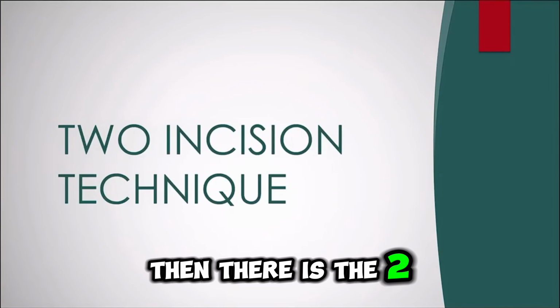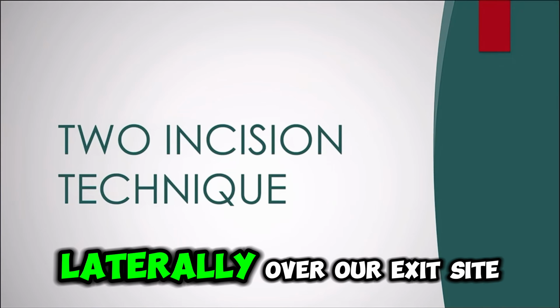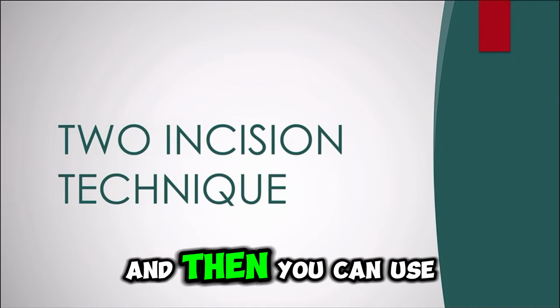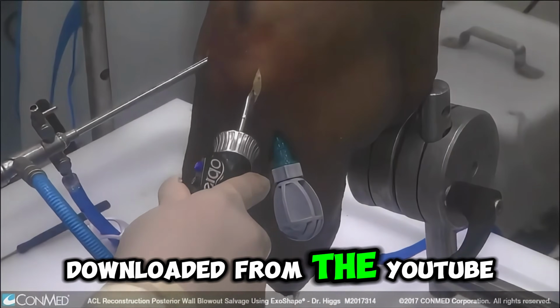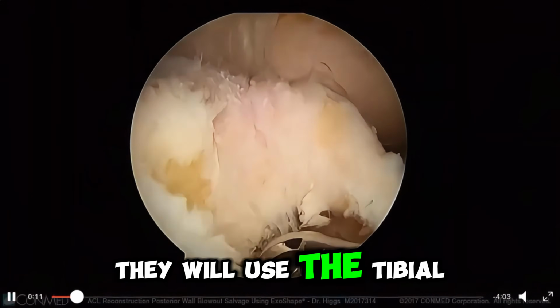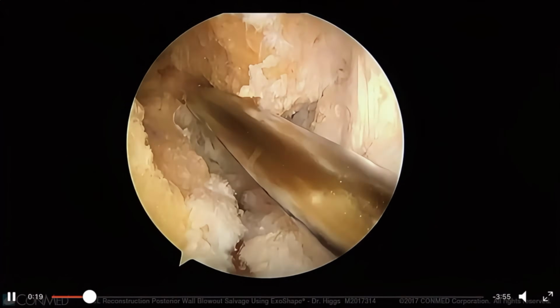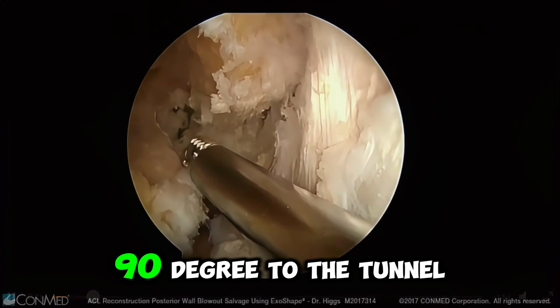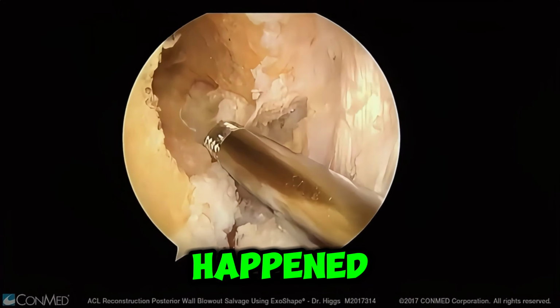Then there is the 2 incision technique. This means you give a small incision laterally over our exit site, and then you can use an ACL guide to make one femoral tunnel. This is one video I downloaded from YouTube. So they will use the tibial guide here to make one tunnel 90° to the tunnel where the posterior blowout has happened.